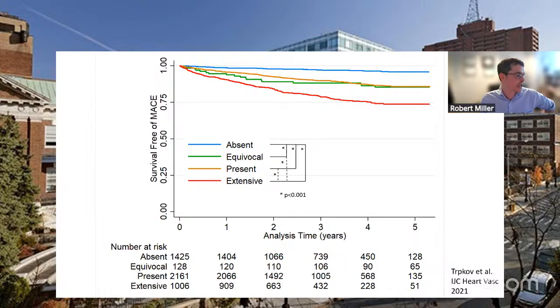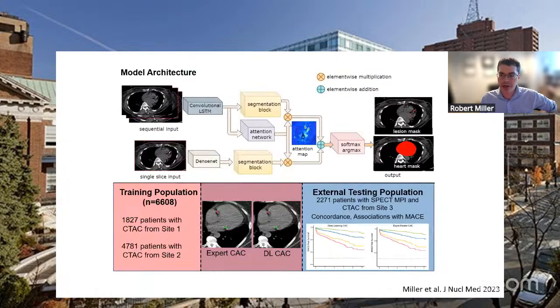The trouble with CT-based or hybrid CT is that they're acquired at very low radiation dose, so the image quality is very poor. And it's a limited number of slices, so it's not exactly the same as a coronary calcium score.